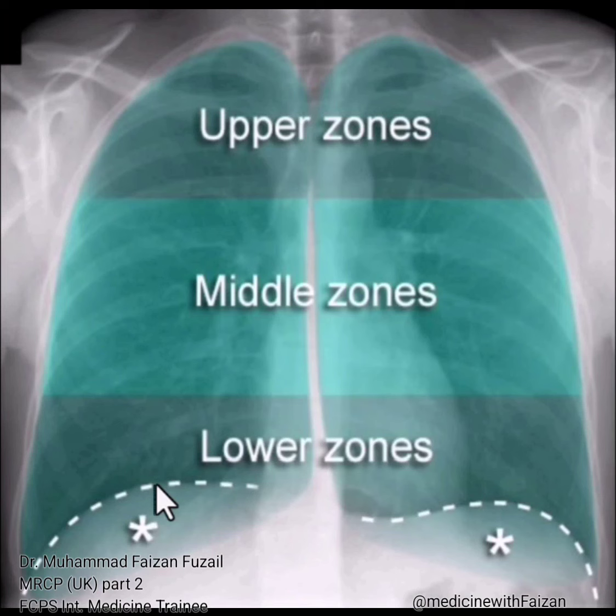If there is genuine asymmetry, decide which side is abnormal. Often a dense or whiter area is abnormal, such as in pneumonia or lung cancer, but some diseases cause reduced density, that is blackening, as in pneumothorax. If there is an area that is different from the surrounding areas of the same lung, then this is likely to be the abnormal area.